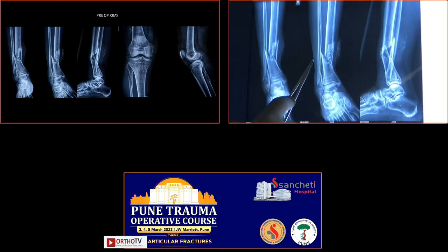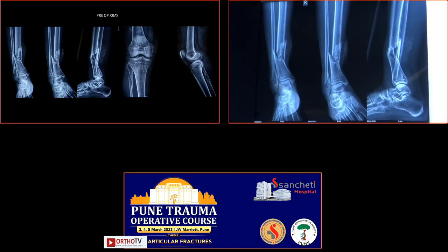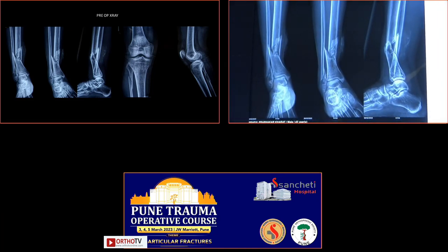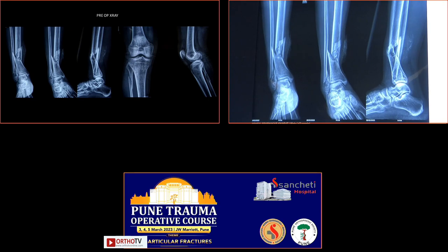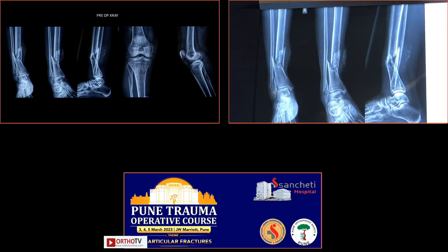Chetan, let's talk only about fibula. Why did you fix fibula? So the plan as decided by both of us was to start with fibula plating so that we get some length and the reduction of the tibia becomes easier.